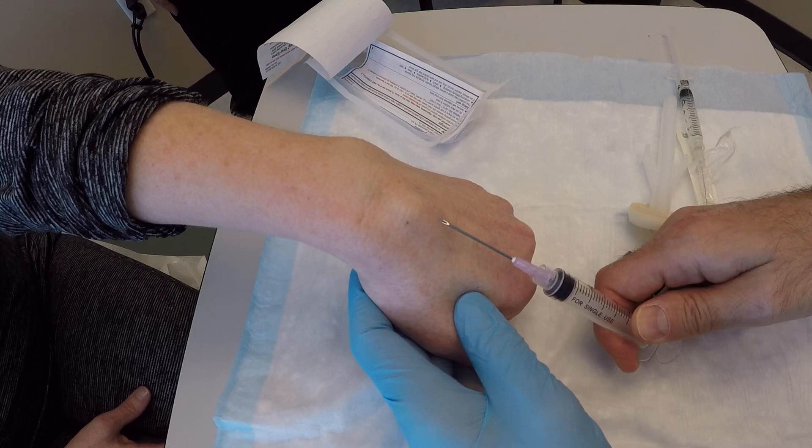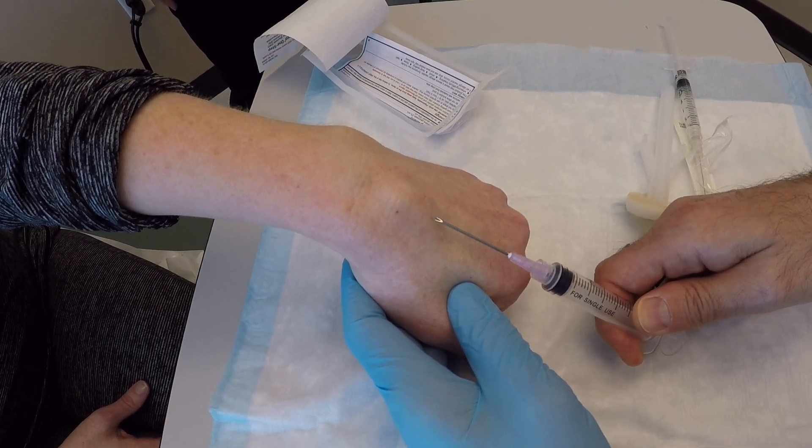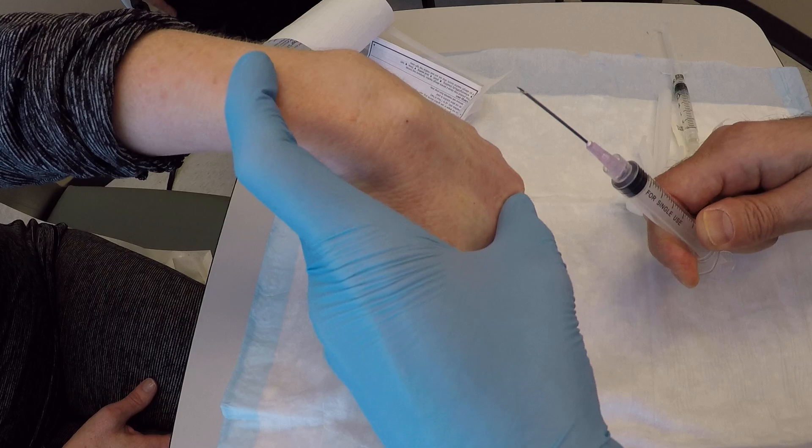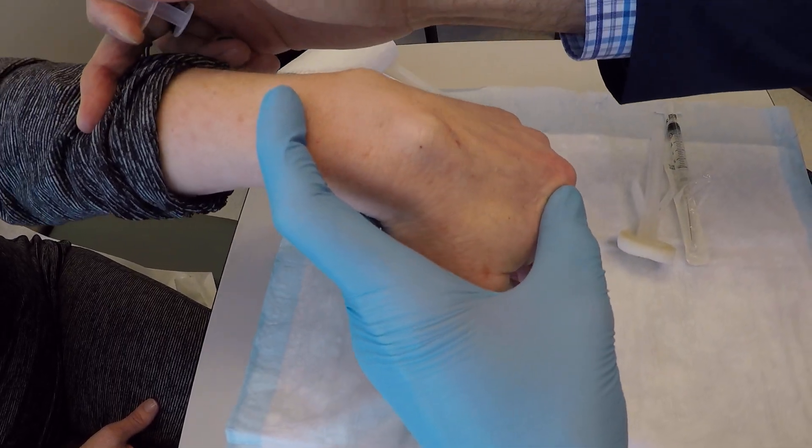All right, ganglion cyst. So I'm going to scratch it here. Do you feel that? No. All right, kind of flex your wrist a little bit more, and lift it up towards me like that. Try to bend your wrist. There you go.